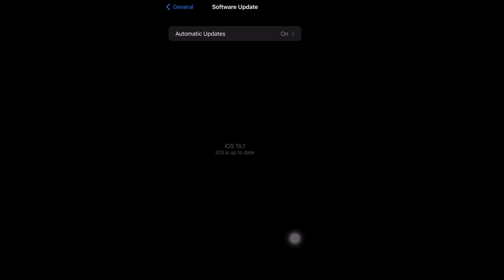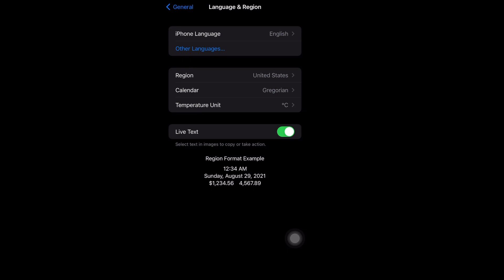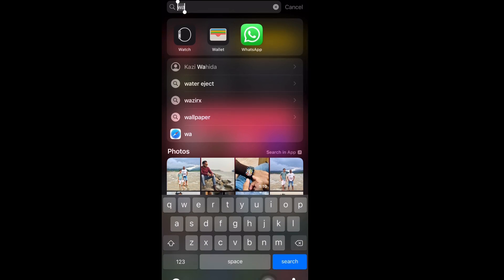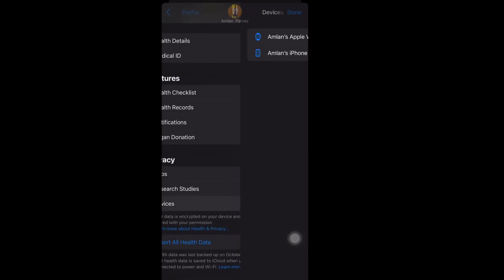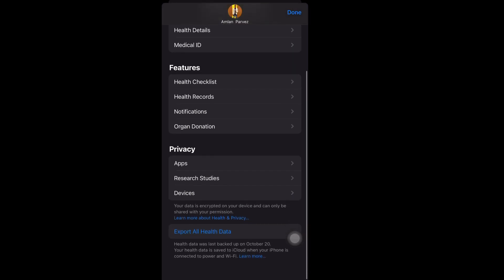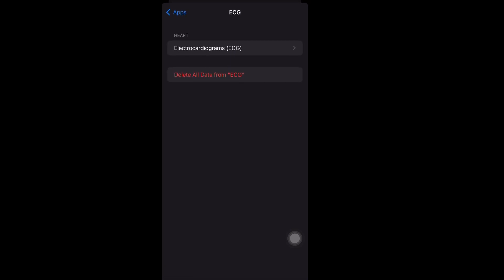Now go inside the Health app. At the bottom right side corner, tap on that, and you will get options. Tap on your account at the top right side corner. After tapping, you will get options — under Privacy, tap on Apps. Inside Apps, here you can see the ECG option.